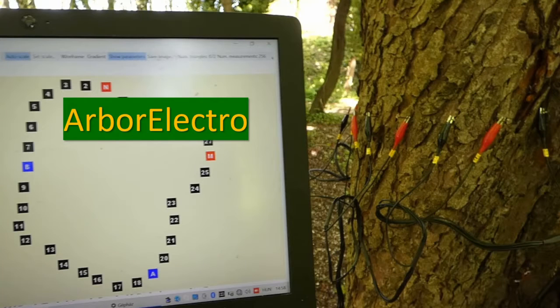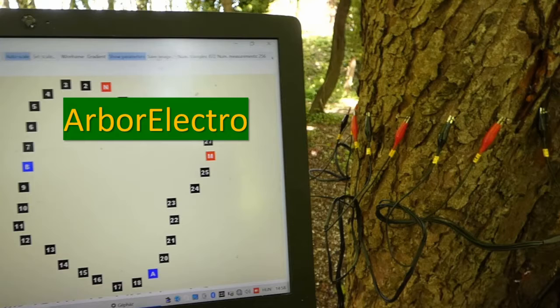Hello, welcome to our ArborElectro video. This video is a step-by-step guide of the measurement with our ArborElectro impedance tomograph.